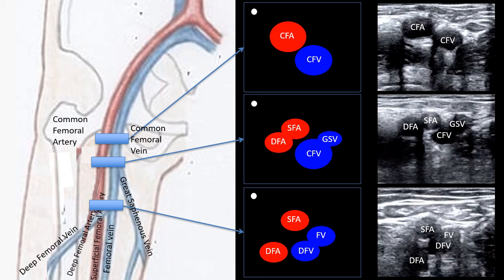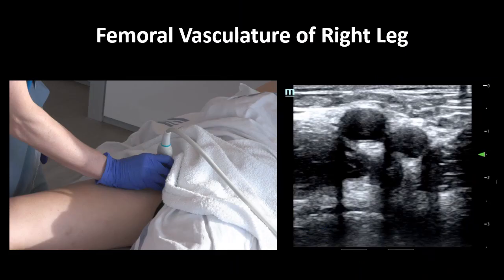It's important to note that these bifurcations can actually be very close to each other in real life. This is the femoral vasculature of the right leg as seen on ultrasound. Focus first on the pane on the right. As a reminder, the patient's skin is at the top of the screen, their femur is at the bottom of the screen, and our indicator is on the patient's right. Medial, or away from the indicator, we see the common femoral vein, and lateral, toward the indicator, we see the common femoral artery.